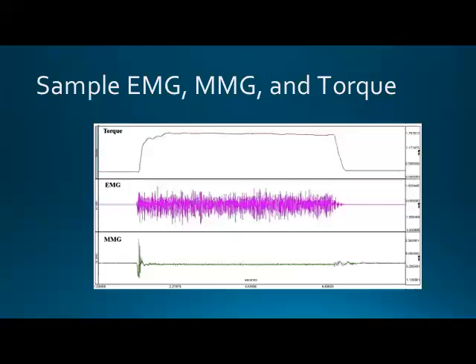So you're going to see an initiation of a contraction, which is going to create a lot of noise because you're getting into position, and then you're going to see a noise cancellation or noise kind of even out. Then we see a little bit more noise at the end when you release, right? So when actin and myosin become separated, you detach those cross bridges, then we'll see another little blip.